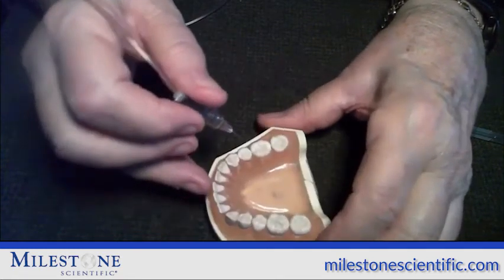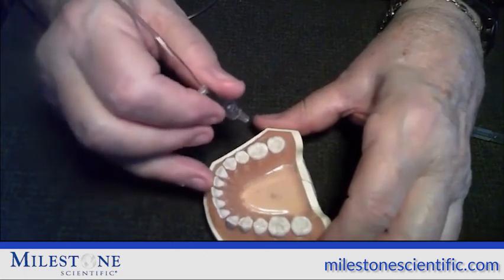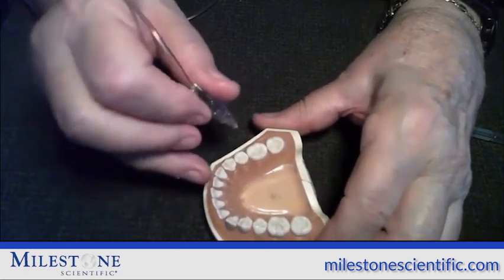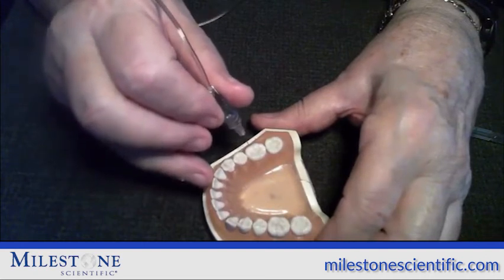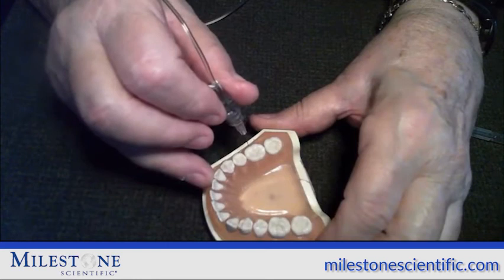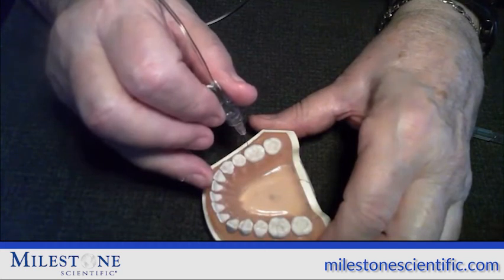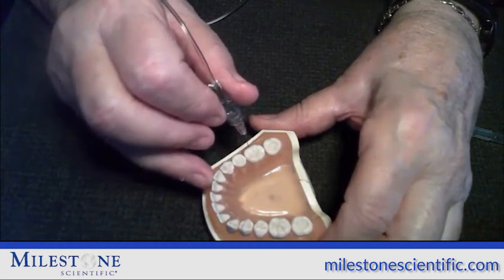Approximately 20% of the lower first molars get innervation from somewhere else, maybe from the long buccal or mylohyoid nerve. So I typically would give another 1/4 of a cartridge on the bifurcation area of the lower first molars only. Just 1/4 of a cartridge of either articaine or lidocaine should knock out 95% of lower first molars.